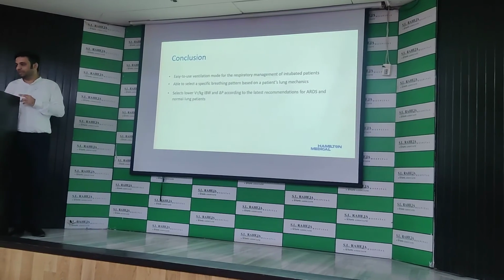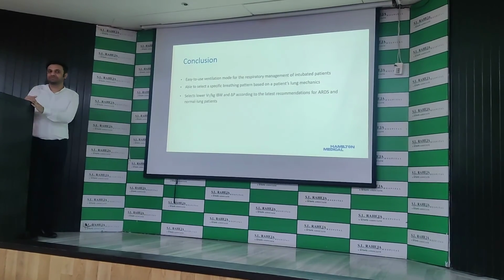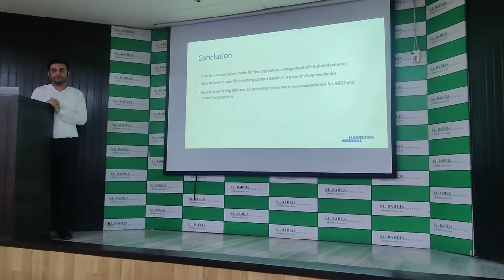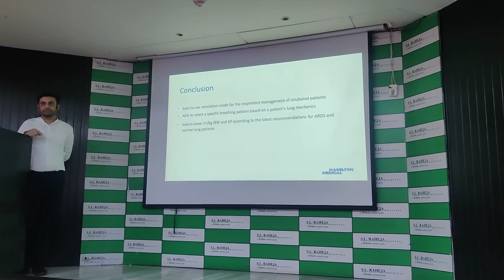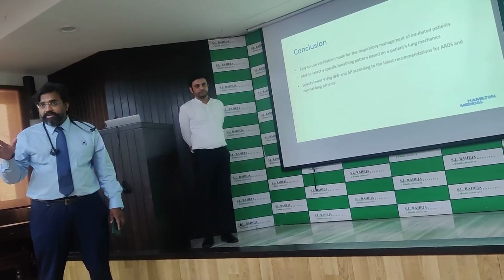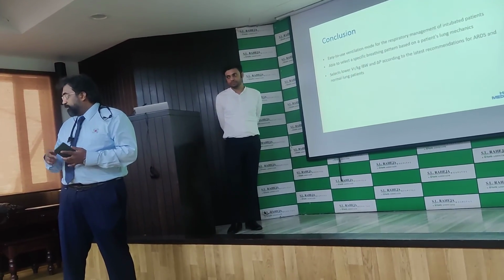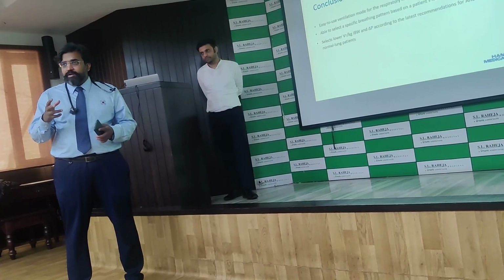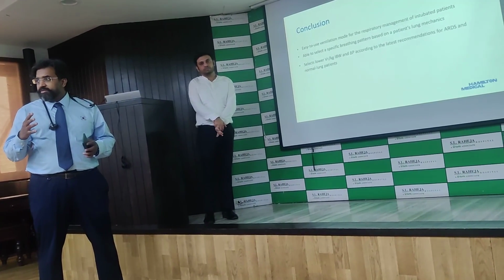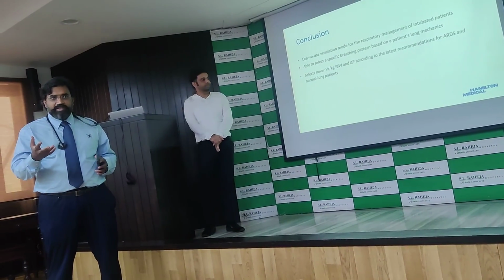So I'm actually very happy that Siddharth and Akash came here to put that ventilator there, because it's not just the use of the ventilator, it's also understanding physiology. By understanding this mode, there's a lot of physiology that we've understood here today. We've understood time constants, and a few things in physiology that make a big difference here. So each ventilator, don't take it that it's just a super class ventilator. It also gives you a lot of physiology understanding. So now you have a new thing that you can look at when you're in the ICU.